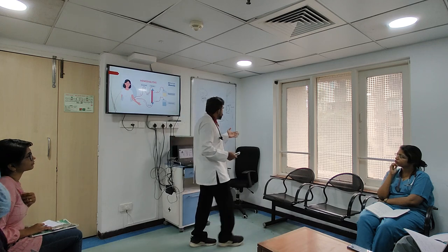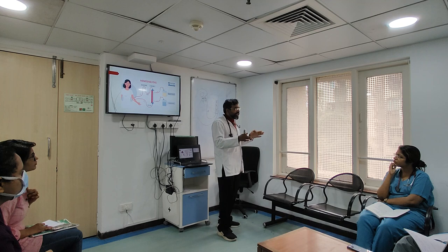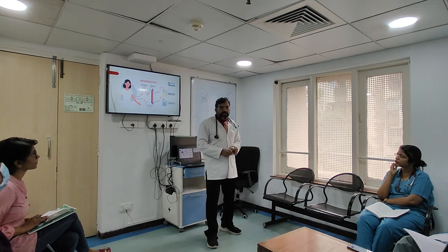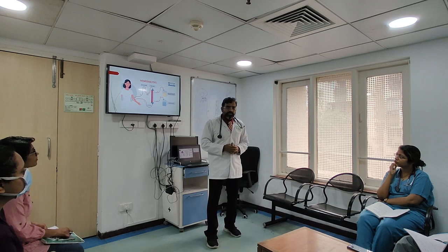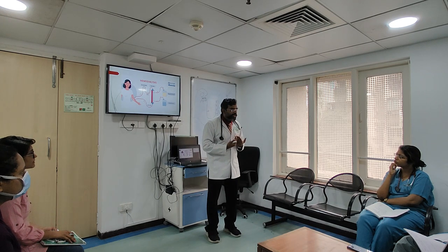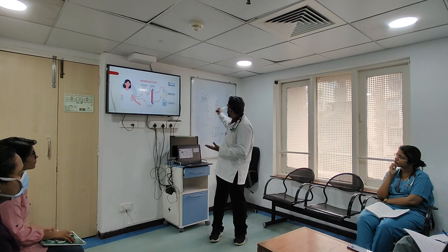You must understand that there will be access recirculation however many changes I do. My therapy flow is going on well, and the next 24 hours it is always back, the moment I do this. This is all the more reason that you must understand that I can't put another jugular line there. That makes sense, right? If you put another jugular line from there, whatever antibiotic I'm giving, whatever noradrenaline I'm going to give, it's going to go from there only.